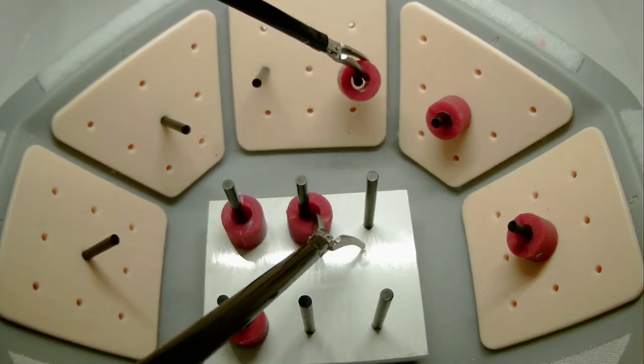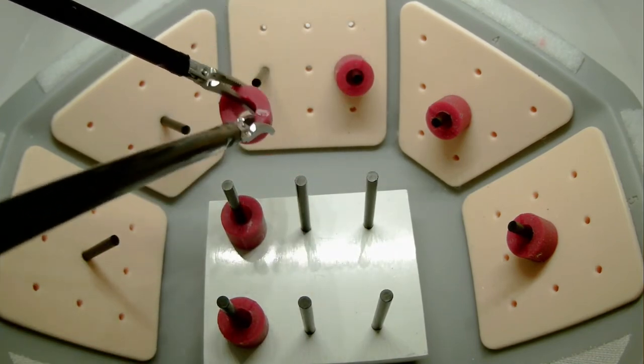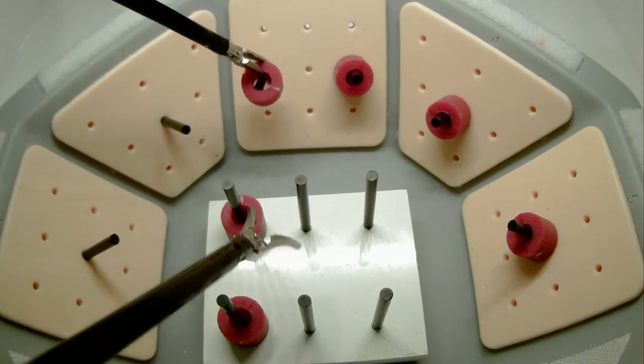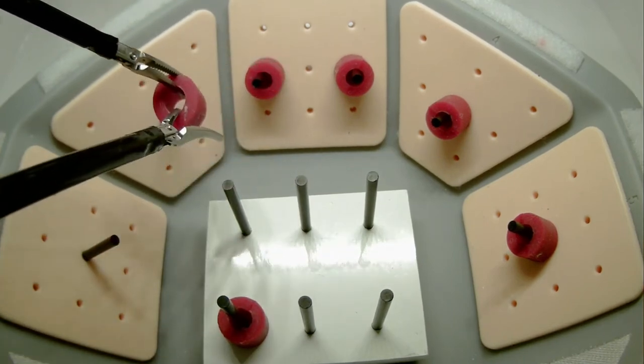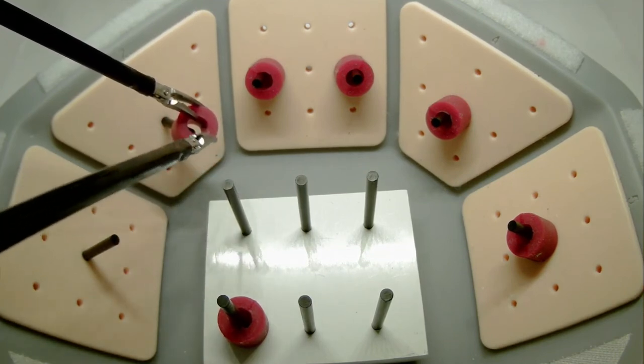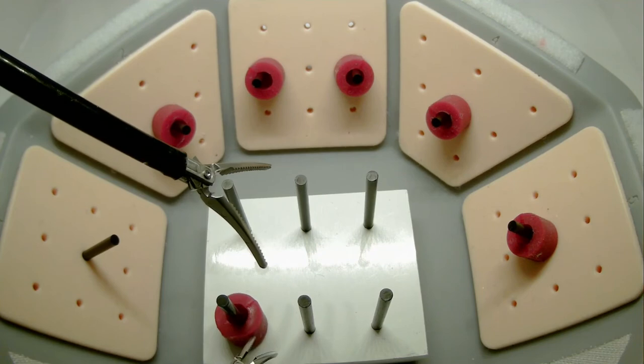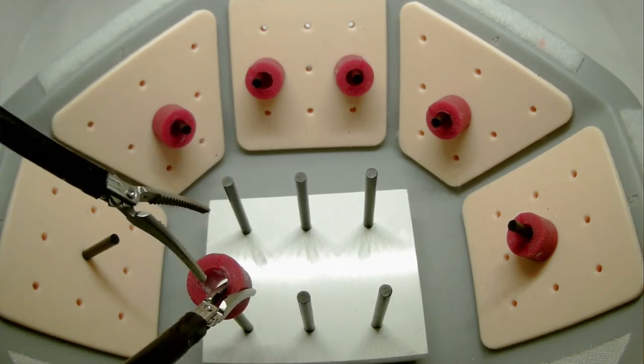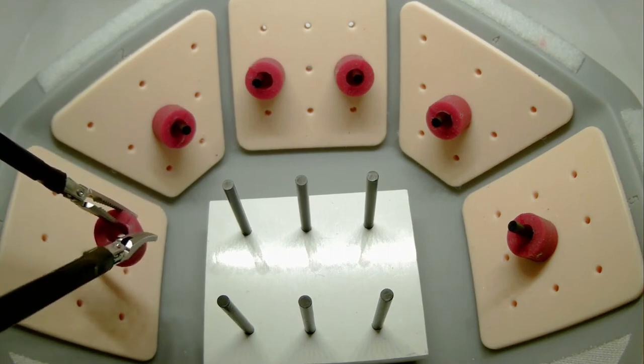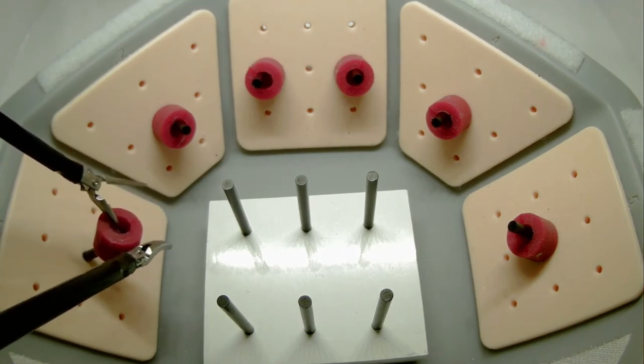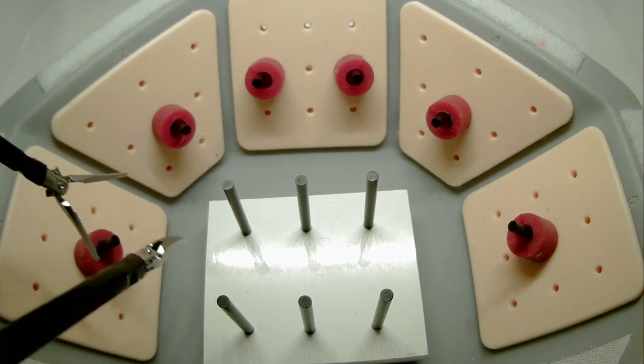You will want to ensure that the sleeve is completely flush to the laparoscopic bowl sidewall. Should you require the assistance of both hands after performing a transfer, you are allowed to do so. Once all six sleeves are on the sidewall pegs, you will reverse your process.